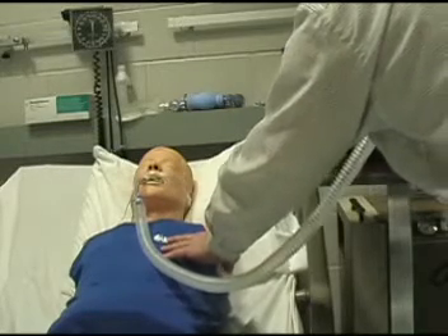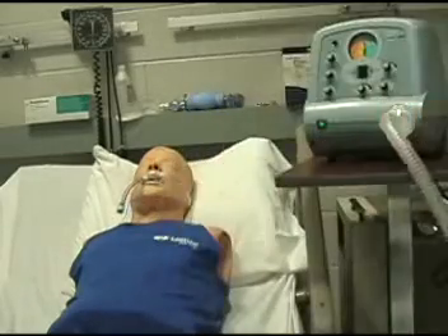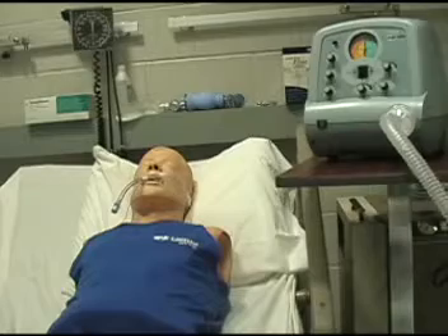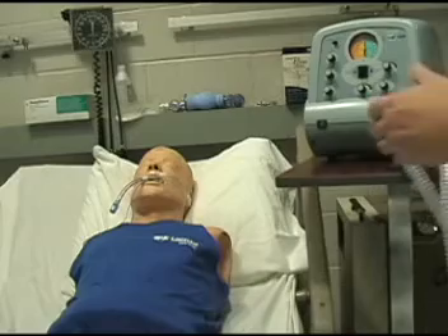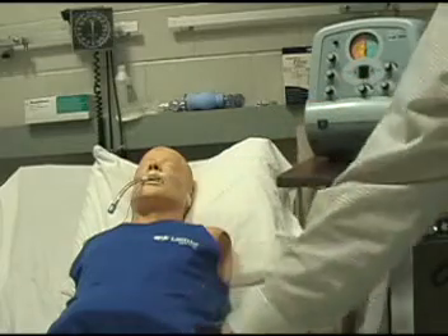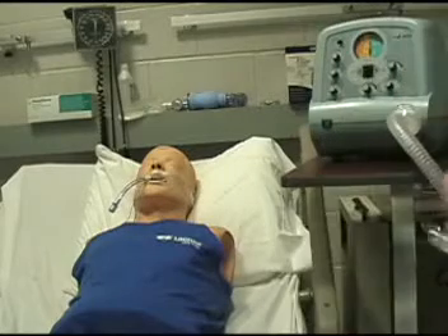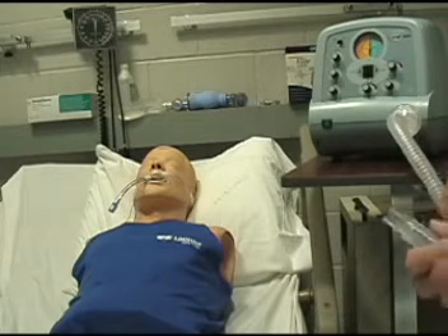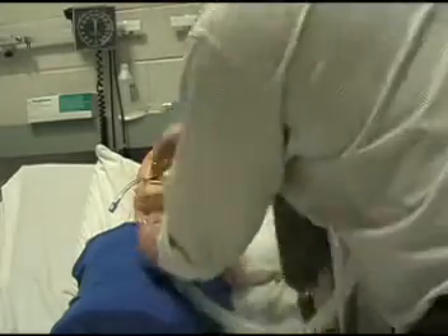You want to do about five or six of those and give the patient a rest. Too much is going to be exhausting for the patient. At this point you may even need to suction out the secretions. After the patient has had a 20 to 30 second rest and you've suctioned out any secretions, you're going to start it up and do the same thing again.